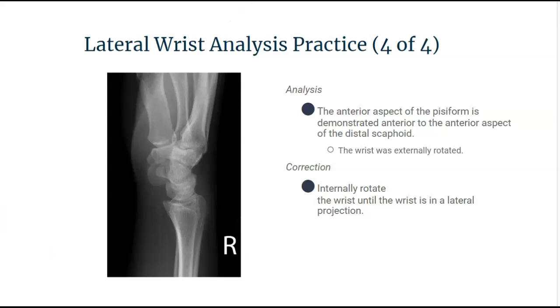Let's look at our last lateral wrist projection. The image looks lateral. However, the thumb is in appropriate positioning. But when you look at the relationship between the scaphoid and the pisiform, the pisiform is demonstrated anterior to the scaphoid. That's letting me know that the wrist was in external rotation. In order to correct this imaging error, we need to internally rotate the wrist until it is in a true lateral projection.